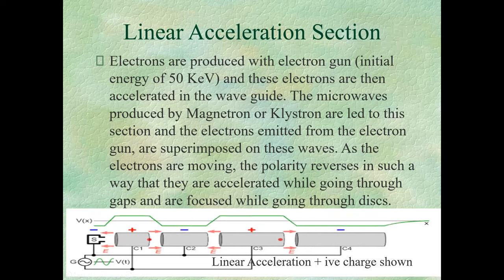increase, but when we are talking of flattening filter-free beam, when we are talking of FFF, the energy is different. When our beam is passing through these flattening filters, the beam hardens, and if we talk about 6 MV, we get a 6 MV beam when it is passing through the flattening filter. But if we remove the flattening filter, the beam is not hardening, and our 6 MV FFF beam is not an actual 6 MV. It is low in energy.